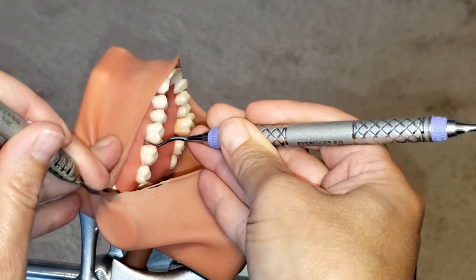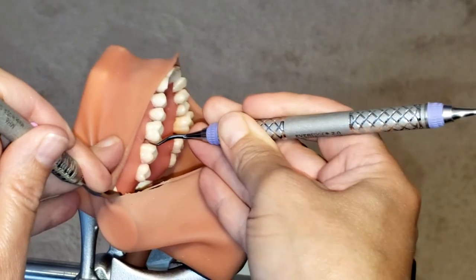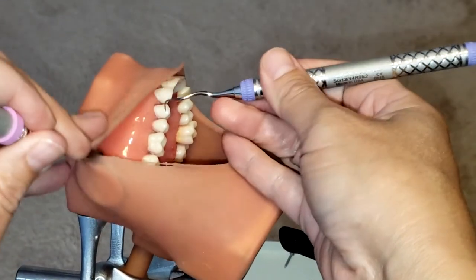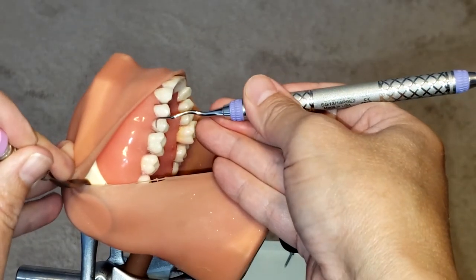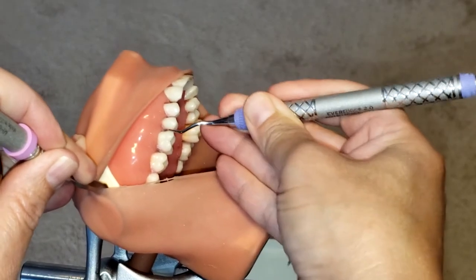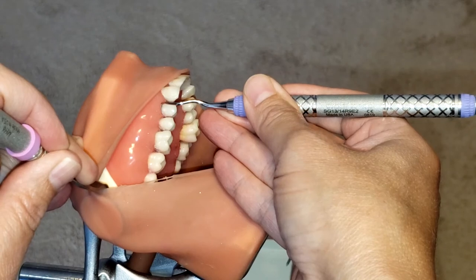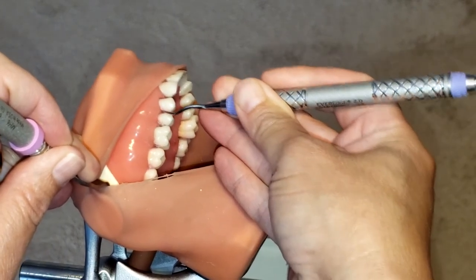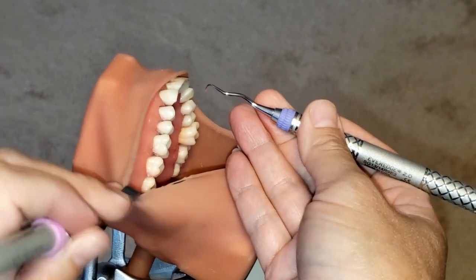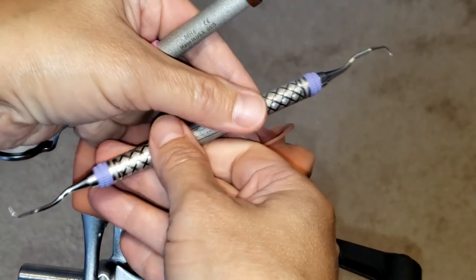Insert, making sure you're going all the way into those interproximal spaces and staying subgingivally. And that is how you use the Gracey 13/14 curette. If you like this video, please hit like and share, and stay tuned for more.